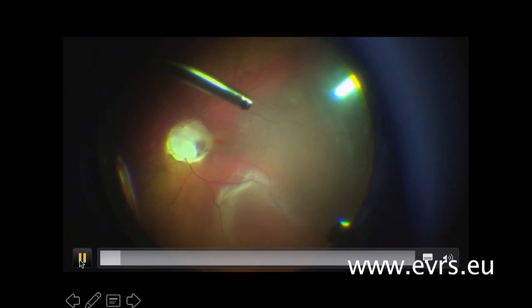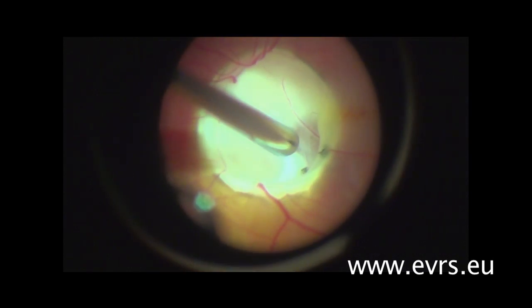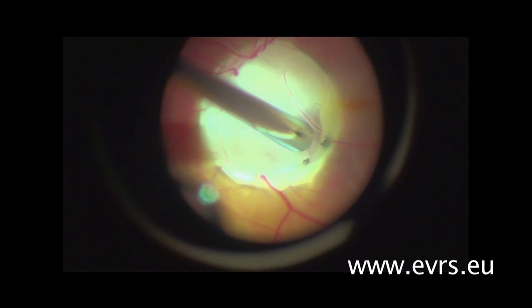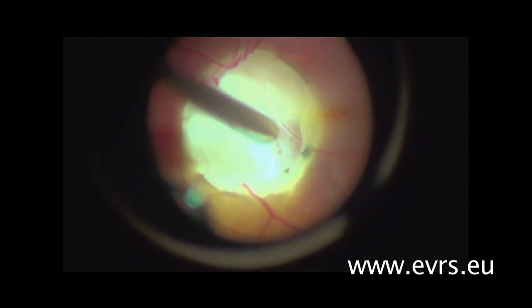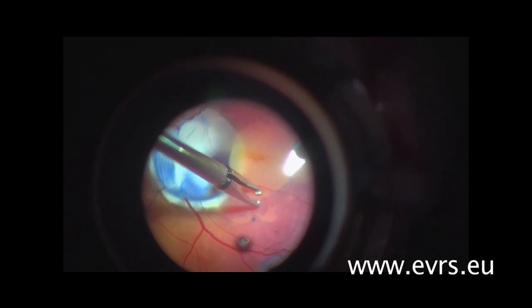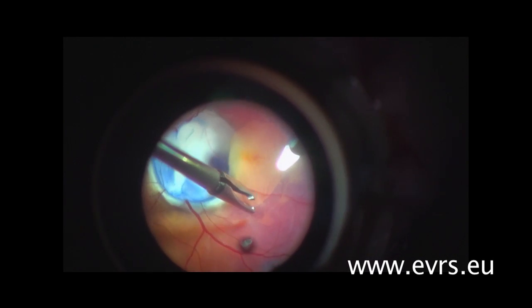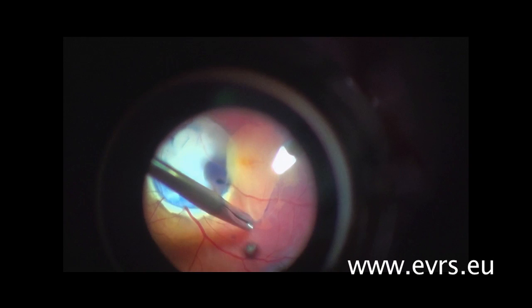Okay, genuinely last video. This is Jersey's video, and I would like to say that I agree with the inverted flap technique in a situation like that. Please, thank you. It is a 9-year-old child with morning glory and optic pit and retinal detachment caused by them. The case was operated elsewhere some weeks or maybe 2-3 months before, and here you see the ILM was already peeled in the center, and the fovea is close to the margins of the morning glory or optic disc.